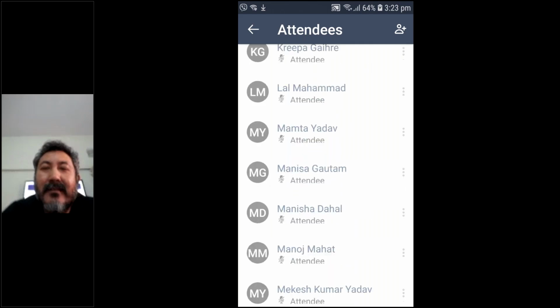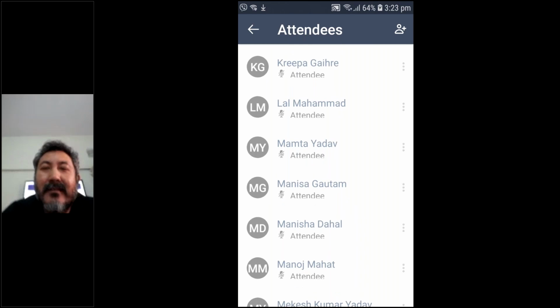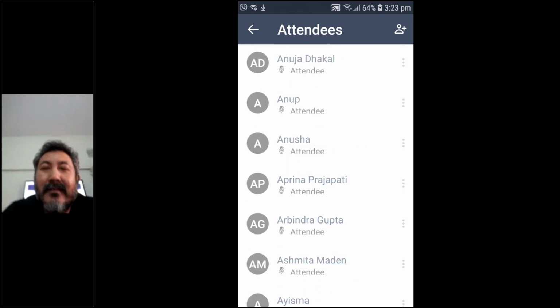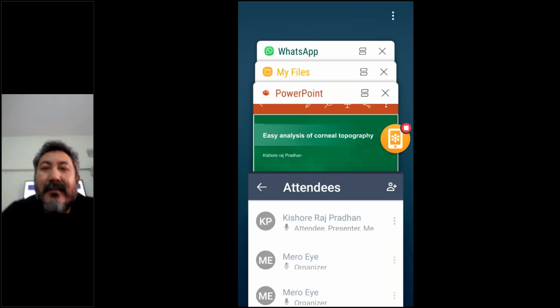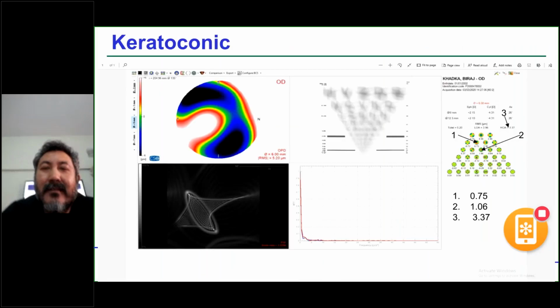I have one confusion regarding optical aberration. For VKC, we generally see it in adults. If a patient who is suffering from VKC still has aberration and high astigmatism, and they want to go for refractive surgery, what things should we consider?